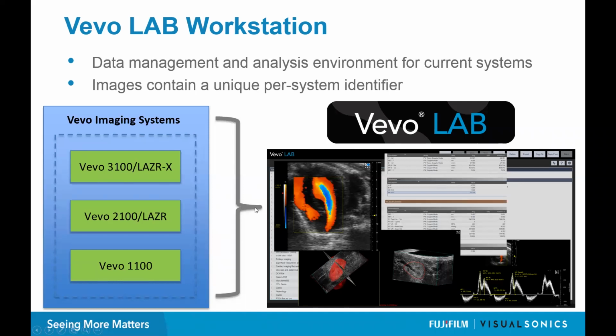So going forward, we will continue to update Vevo LAB and it will continue to move forward, but we will do our utmost to maintain the compatibility to the formats of the data from those earlier systems. So if you're out there working away on your 2100, even though there's really not going to be new software or new tools added to the 2100 system per se, still do try to keep your Vevo LAB workstation install up to date, and you'll be able to access some of the great changes and developments and new tools that we are making available.